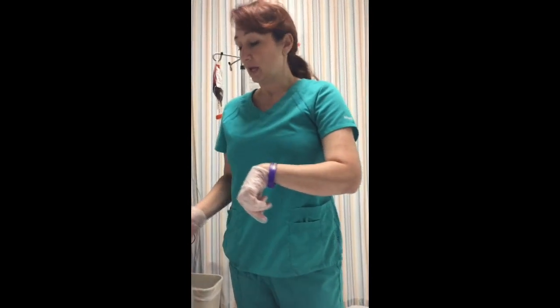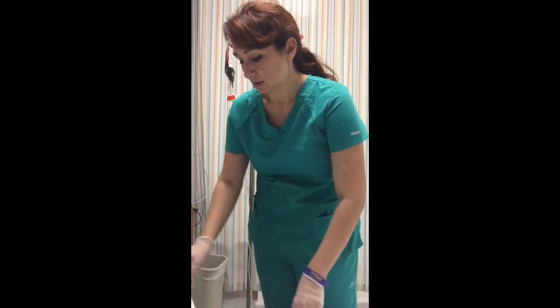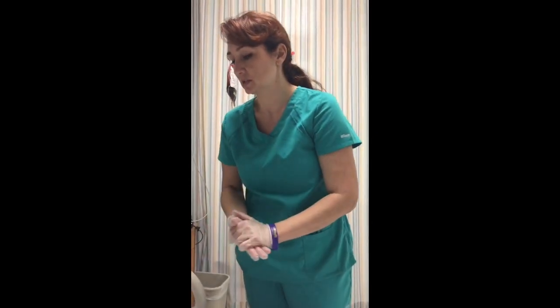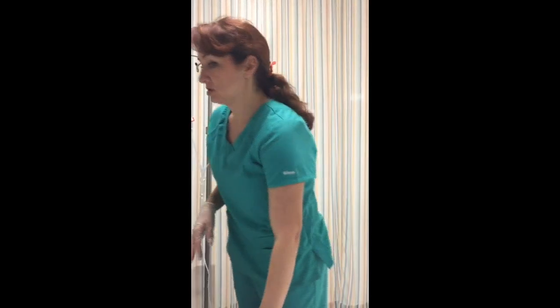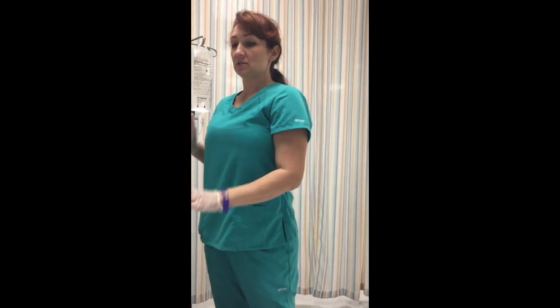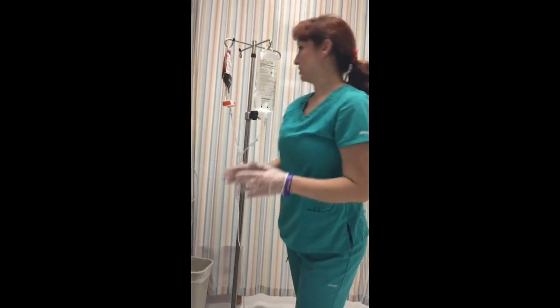Fifteen minutes have passed and she seems to be tolerating the infusion well. We're going to take another set of vital signs — blood pressure, pulse, respirations, and pulse ox all look good; no temperature. If you do notice a reaction, stop the infusion immediately, take everything down, and set it aside. Get a new bag of normal saline with fresh tubing and start flushing at 40 milliliters per hour. Get another set of vital signs and notify the ordering physician and the blood bank.